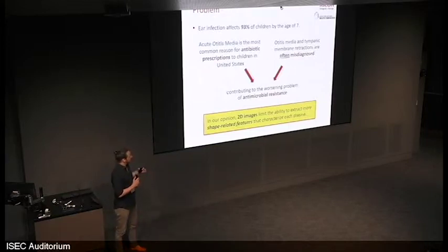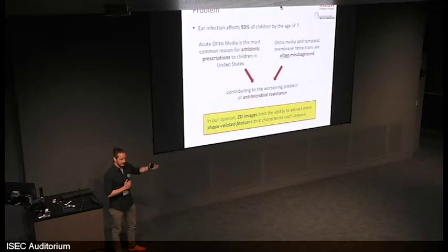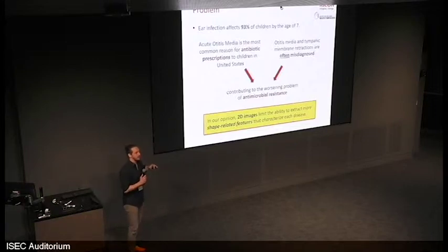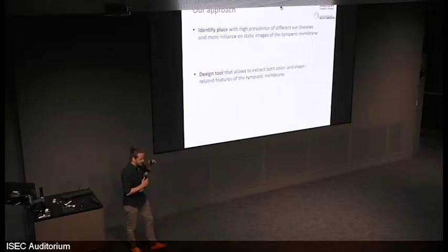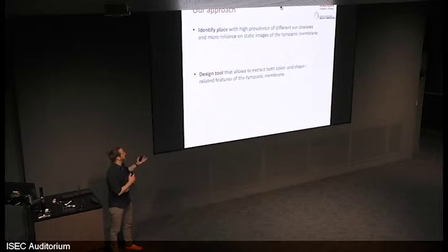Our goal is to find a way to bring the accuracy of a specialist into the hands of a pediatrician. Now, to do this, we investigate a learning-based approach. But first, we want to say, well, let's wait. First, we should probably give a tool that is capable of extracting more information, so the learning will be easier. Our approach is first to identify a place with a large variety of ear disease, and then to design that tool.